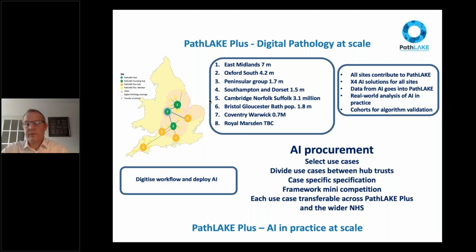An important part of PathLAKE Plus is the delivery of artificial intelligence, both in the form of solutions which PathLAKE ourselves has started to create. We will be looking to do that, but also in the short term by the procurement of commercially available solutions which are on the market right now and which we'll be looking to put into practice across these sites. We hope to be able to do so in such a way that we provide near equal access to this AI for all of these sites taking part.